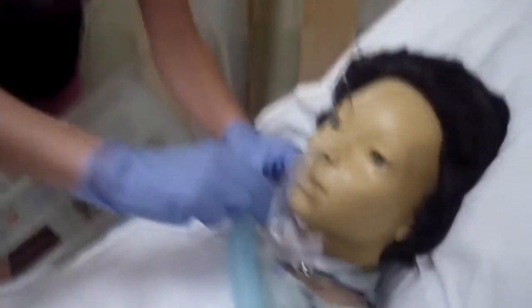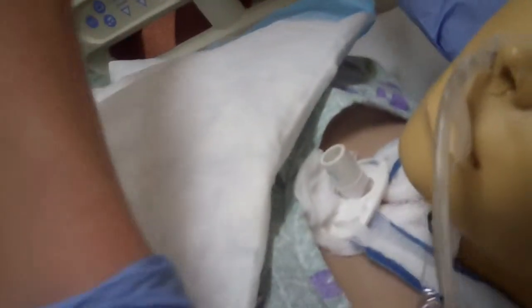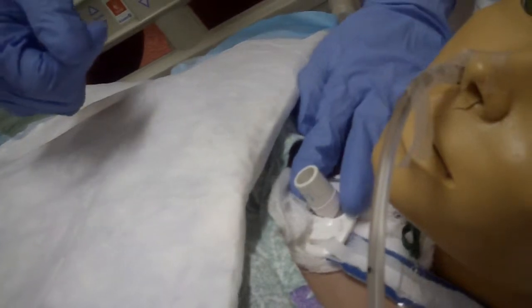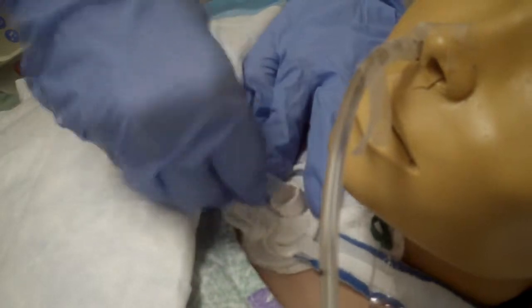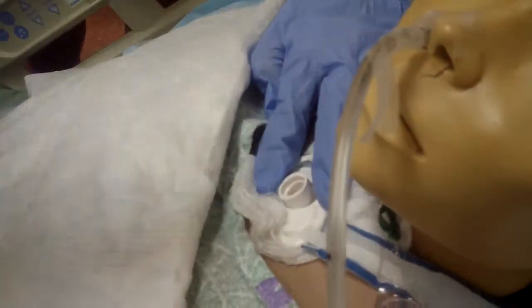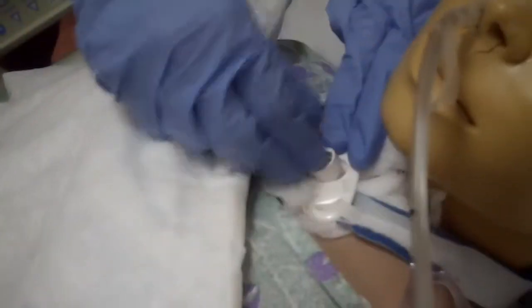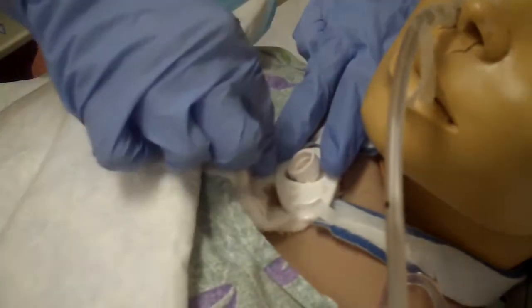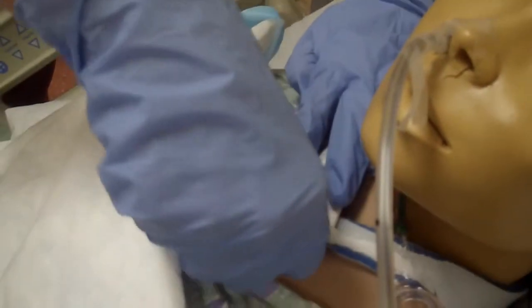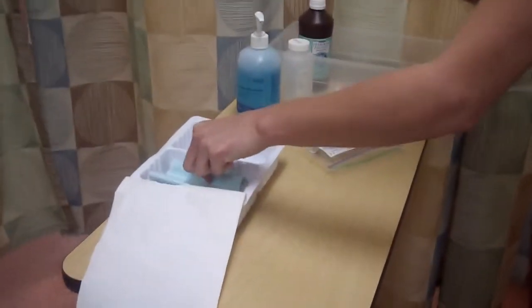I'm going to remove Miss Jones' oxygen, set it aside, hold the faceplate with my left hand and unlock the inner cannula. Pull it out gently and discard of it. And I'm also going to take the soiled dressing off. I'm going to throw that away. Take these gloves off. Throw those away. And I'm going to come over here, set this aside because we're not going to use that.